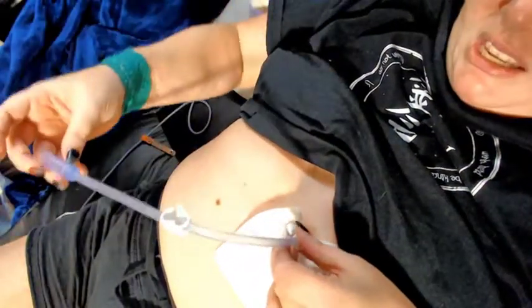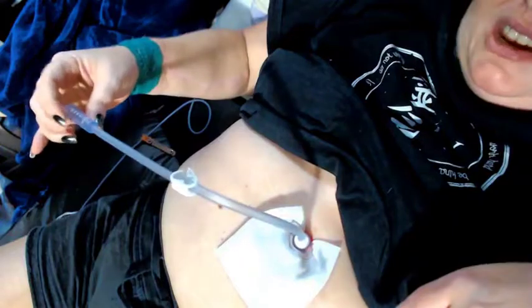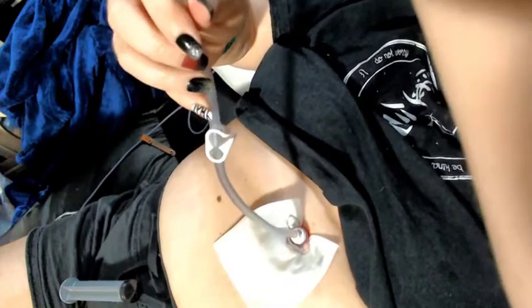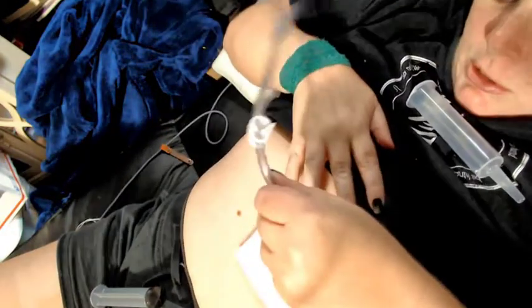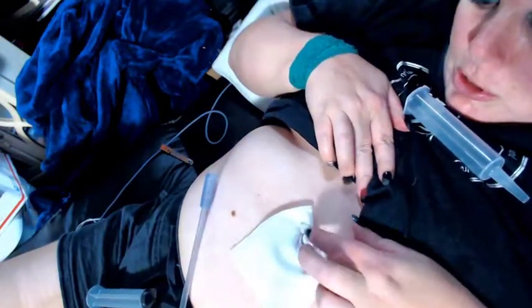But before, like when you first get a feeding tube put in, what you have essentially is something like this that just literally is always hanging off of your body. In fact, right now I'm going to go ahead and pour some water in it just to make sure it flushes out and everything works like it's supposed to. Yep, the water went in with no problem. Alright, so that is it, guys.